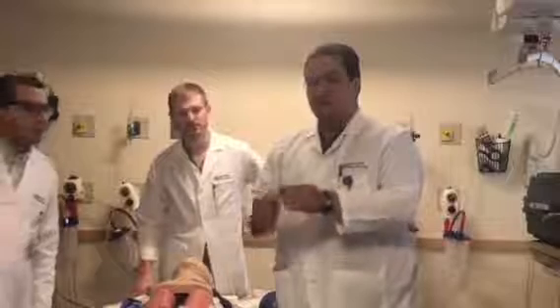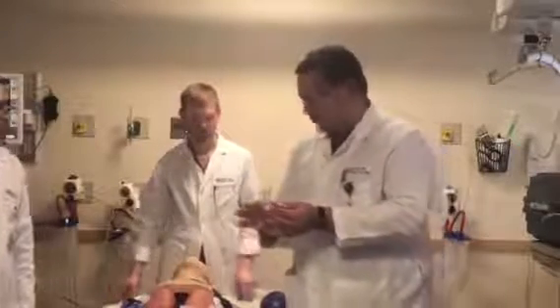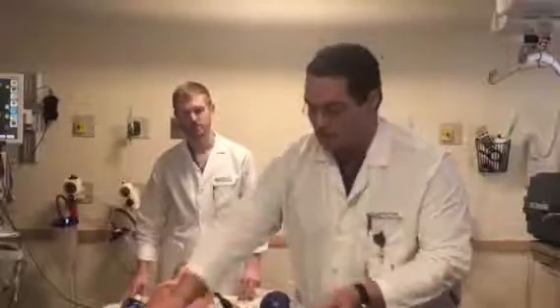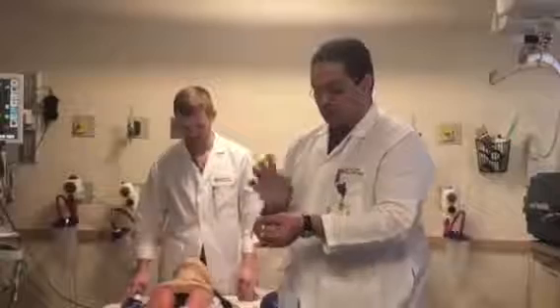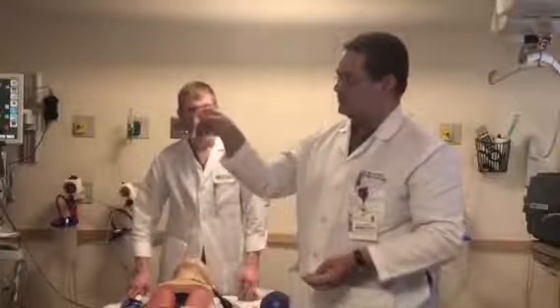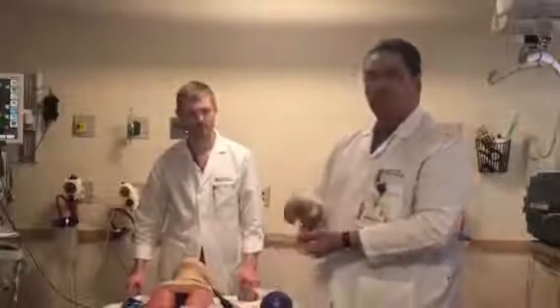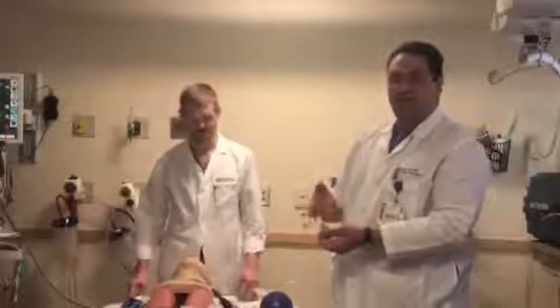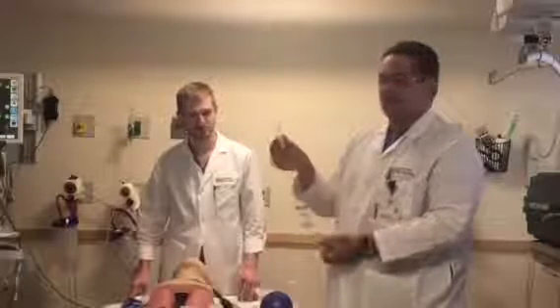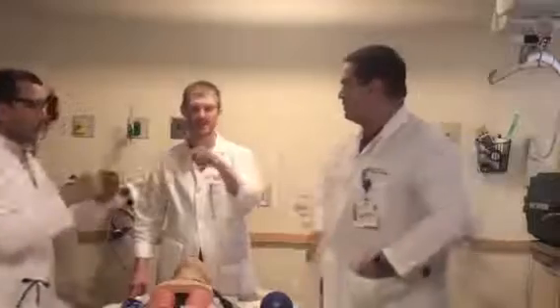Basically, take a 3 cc syringe, remove the plunger, and take a 7 tube adapter, the adapter in the upper part of the tube. After you remove the plunger, shove it in the 3 cc syringe, and this way you can hook an ambu bag here. By hooking an ambu bag, you simulate the way the jet ventilator works. This is the cheapest jet ventilator ever: a 14 gauge angiocath and a 3 cc syringe.